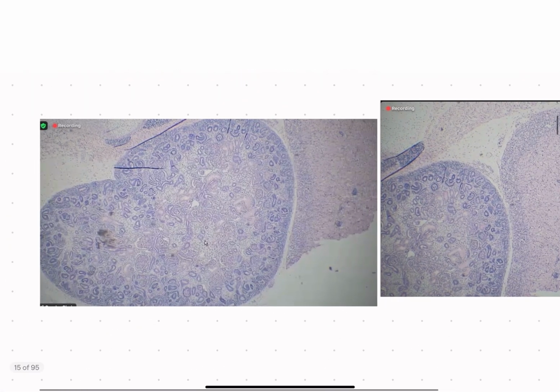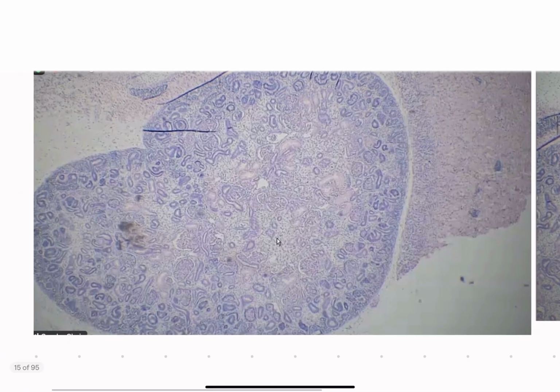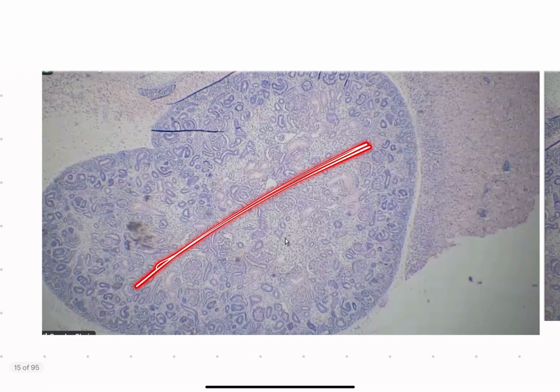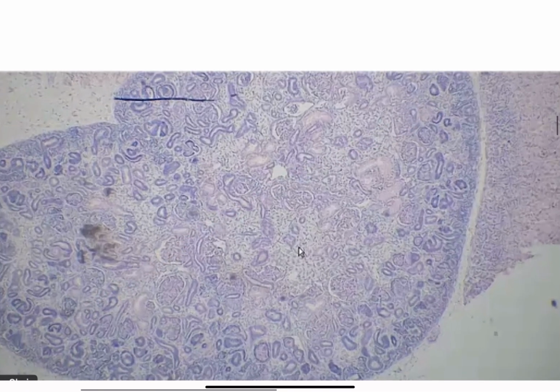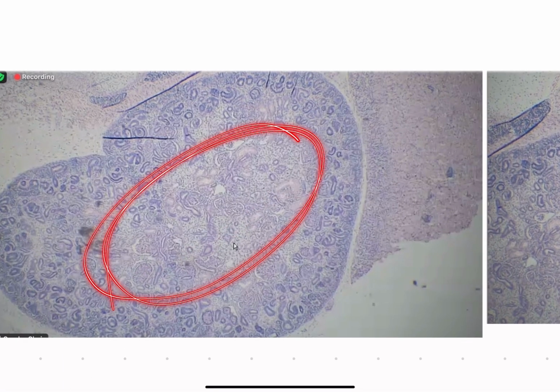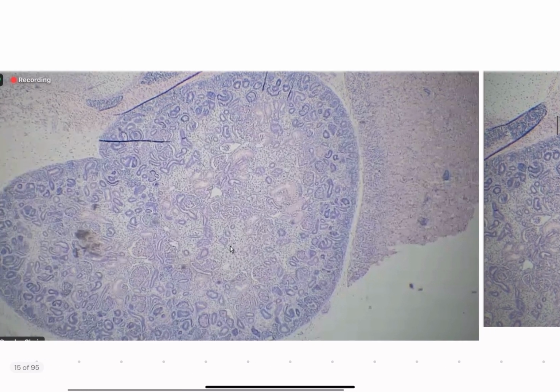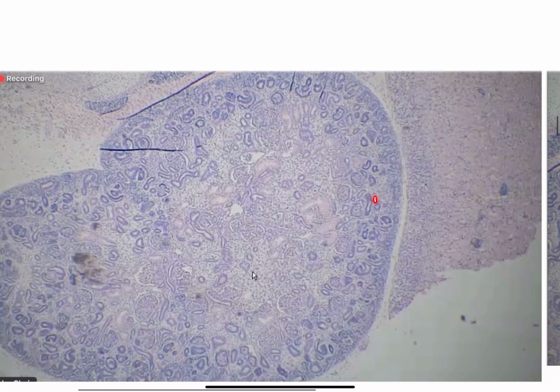Okay, these are separated adrenal gland and metanephros structures for this slide. And here we can actually see no clear medulla. Even though there's a light center, this seems to be a weird cut, so we get a lot of the cortex still within the center. We should honestly only have mesenchyme here, none of these other structures in the center, if this was truly the medulla. But here we could definitely ask you about the differentiation of nephron.